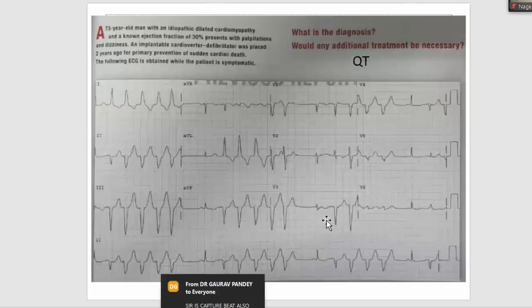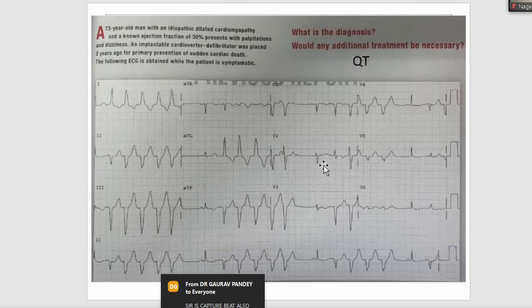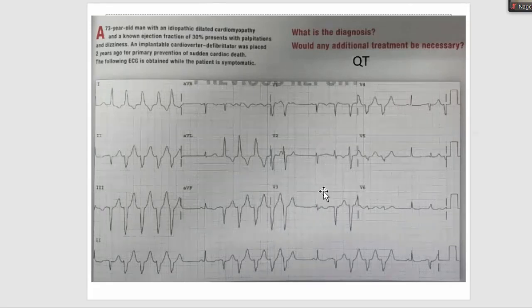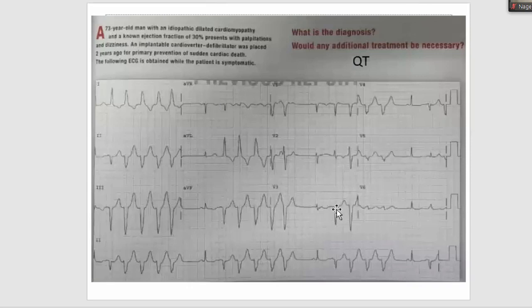First, look at the sinus beat and examine the T wave, ST segment, and QT interval. The ST segment and T wave appear slightly flat, which is a little unusual. T waves are not normally this flat. In such cases, we need to look for electrolyte abnormalities. This patient is already on primary prevention ICD, so it is unlikely they had VT previously — that's the first point.